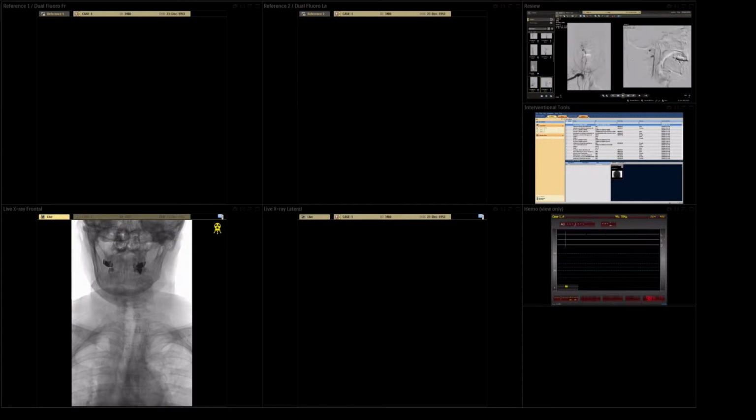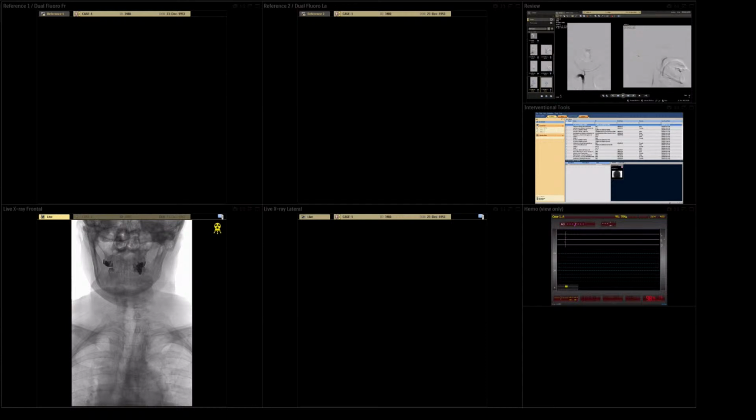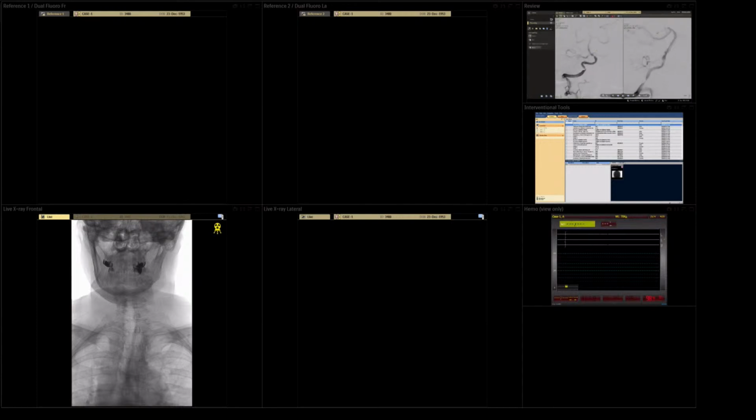The vertebral artery on the right side. Patient is moving. That's why Dawlet repeated angiography, and contrast is diluted at the basilar artery. But V4 segment is stenotic, and basilar looks also diseased. And let's measure the vertebral and the basilar.